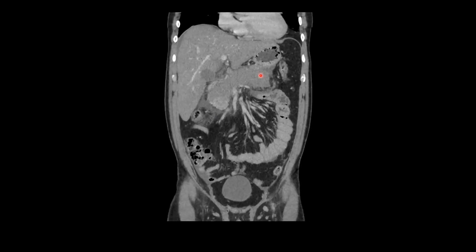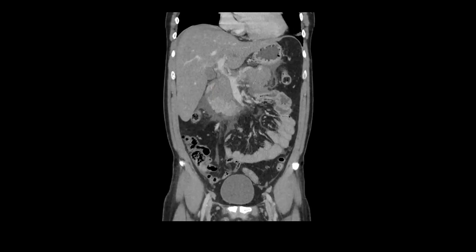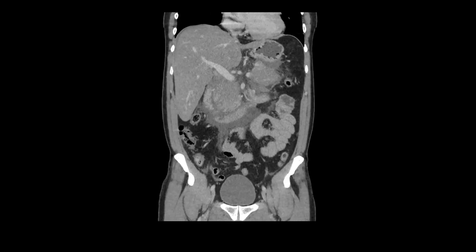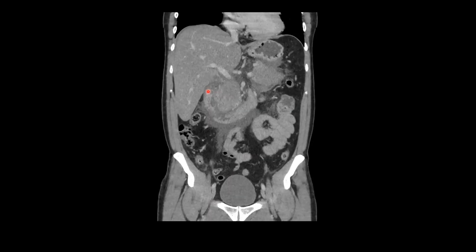This is the area where we have necrotizing pancreatitis, with some sparing in the pancreatic head. Coronals are also a great way to look at the duodenal sweep. You can see the duodenal C loop extending down with the pancreatic head. The area between the pancreatic head and the duodenum is known as the pancreaticoduodenal groove, which has a bit of fluid within it. There's also some reactive duodenitis here — reactive inflammatory changes from the extensive pancreatitis.